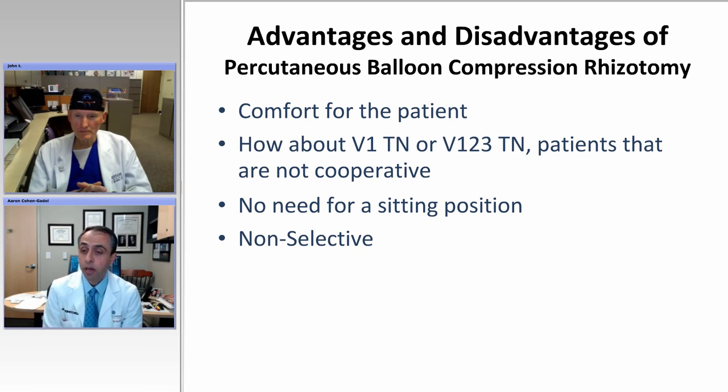I agree with you. I've done about 300 of these percutaneous procedures so far, and I can tell you that I have hit the carotid artery once, and it's very dramatic. There's no question the flow of the blood would shock you, because especially we've never seen it before. And we just withdrew the needle and woke up the patient. The patient was intact. We did a CT angiogram to exclude a fistula or a pseudoaneurysm and repeated another scan in 2 weeks, and the patient did well. And miraculously, her pain went away as well, and that probably was because just entering the foramen, you injure the nerve, and that was just good enough.